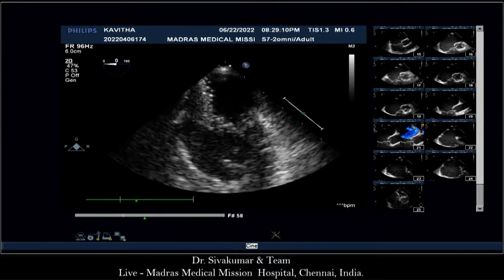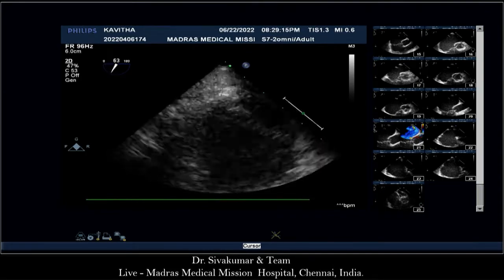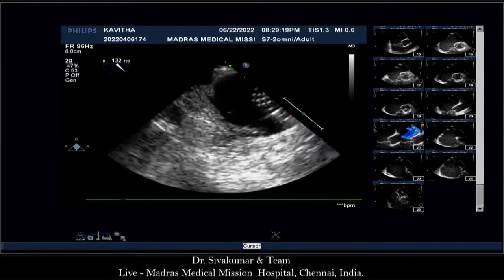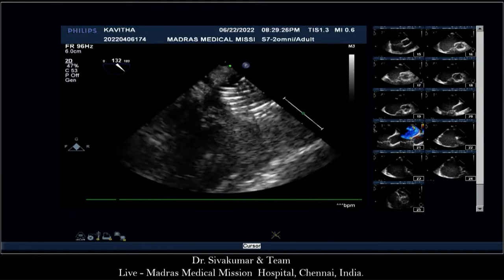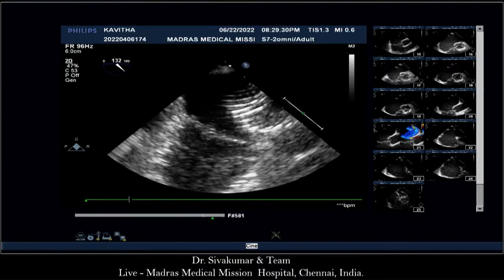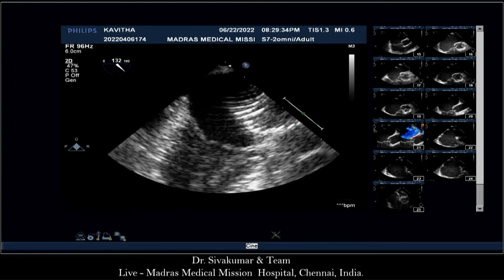Yeah, I think the problem with all these mitral valve things is that the device is always in front of the valve. I think you should have a transthoracic view as well, because then you have the valve in front of the device, and that perhaps might clarify the situation a little bit better. Whichever way it works, we need to look at the mitral valve because it's a pretty large device. Can you see it, Zahid, now? 6 by 28 by 31.